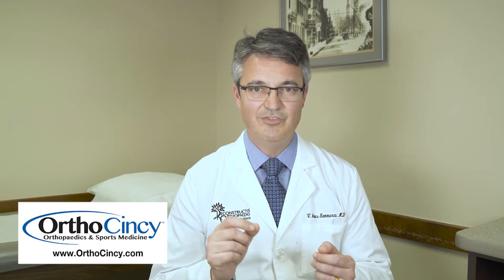The ultrasound lets me inject very small joints that I probably wouldn't be able to inject at all, which can give us much better relief of symptoms. It also lets me give those injections a little bit less painfully, because we can see exactly where we're going, take a direct path, and we don't need to move the needle around a lot once it's inside the patient. So it can improve our effectiveness and make the whole procedure a lot less painful.